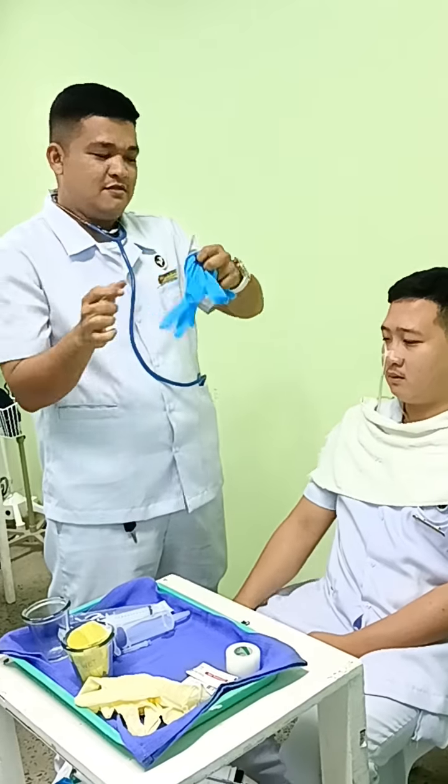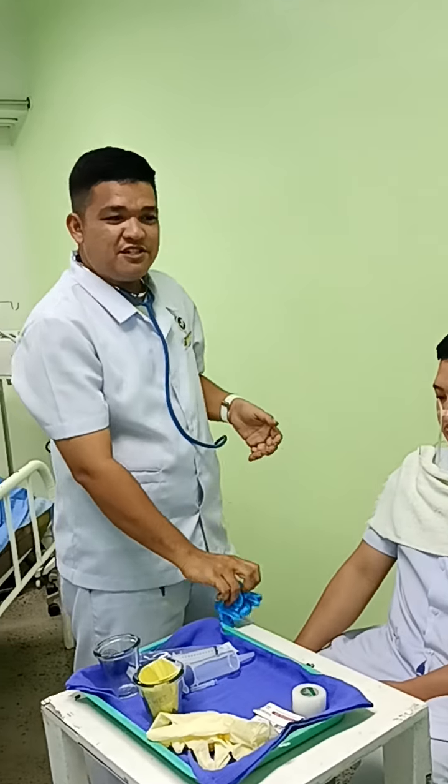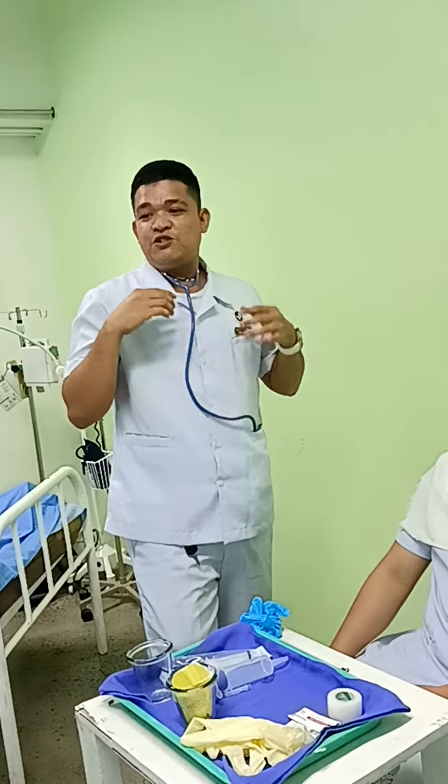And if there is any presence of gastric residual volume, we're going to measure it. Then remove the gloves and start washing. Last but not least is to document the findings.